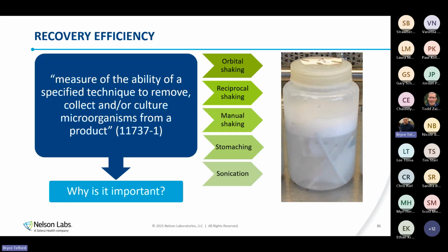So let's talk for a minute about recovery. But Bryce, we just talked about recovery. Why are we talking about recovery efficiency some more? Well, the answer is because every single auditor is going to look at your recovery efficiency. So why is it important? Because your entire dose setting for radiation sterilization often flows through that recovery efficiency. Radiation is bioburden based. We look at and establish our doses based on that bioburden, and we generally don't have that bioburden estimate without that recovery efficiency.